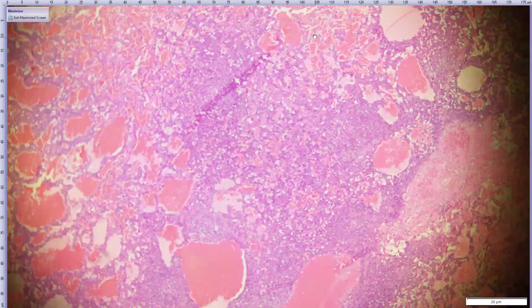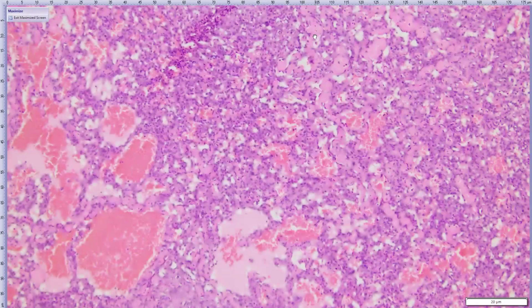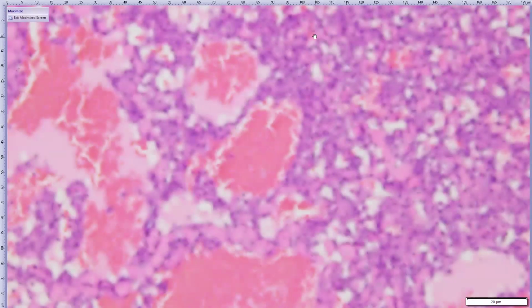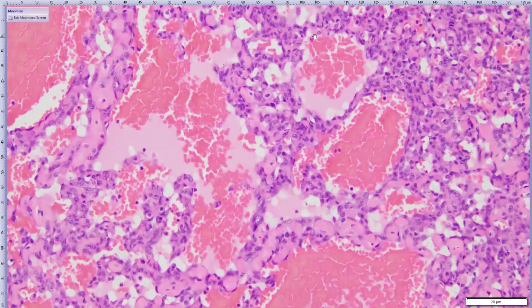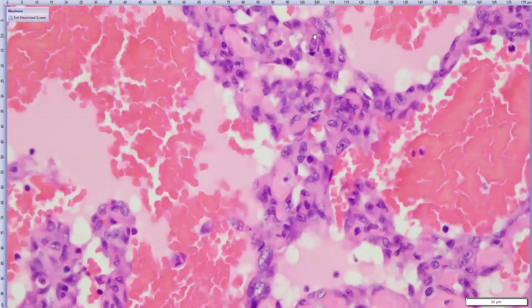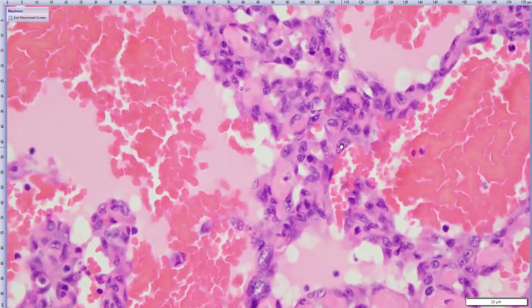If we zoom in on this neoplasm where it's still viable, we have anastomosing beams of collagen which delineate dilated, blood-filled aberrant vascular channels and which are lined and infiltrated by a spindle cell population. These spindle neoplastic cells have pretty plump and large nuclei, a coarsely clumped vesiculate chromatin pattern, and typically at least one distinct nucleolus. So again, pretty active cells. I got 15 mitotic figures in 10 high magnification fields.